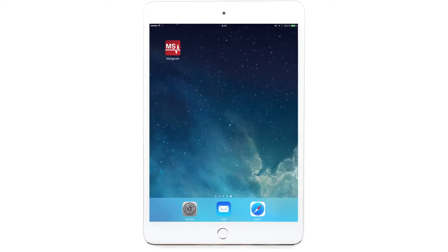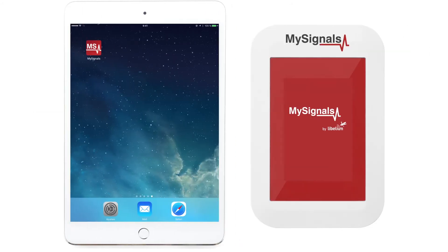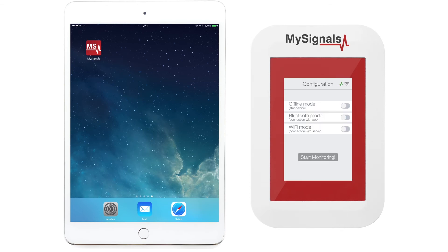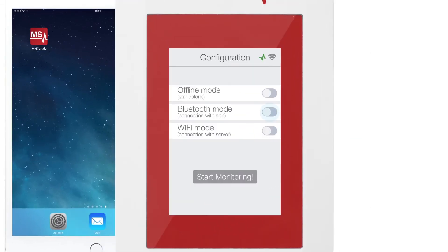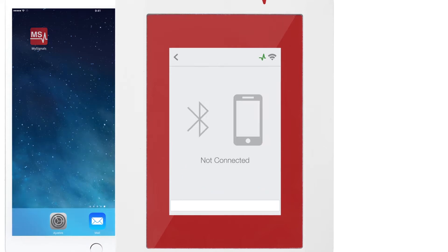When you power MySignals, it goes directly to the configuration menu. Select Bluetooth connection and click the Start Monitoring button.